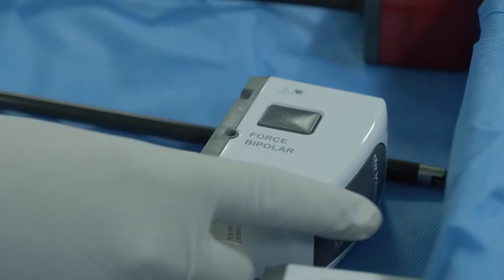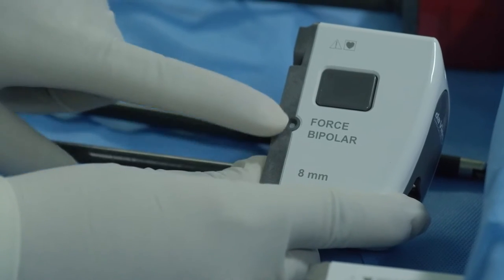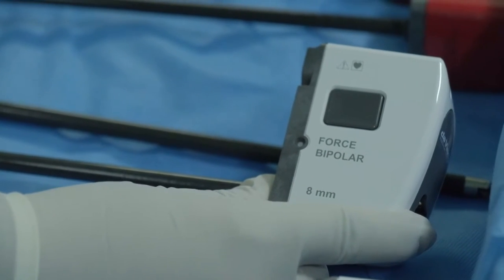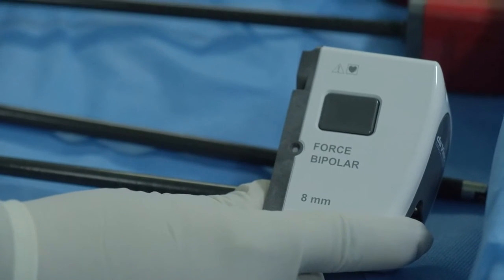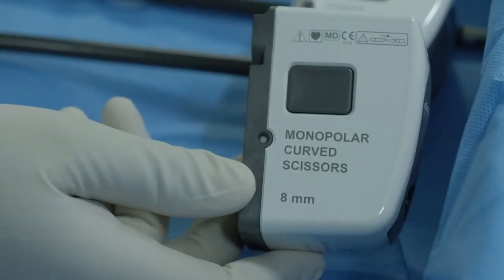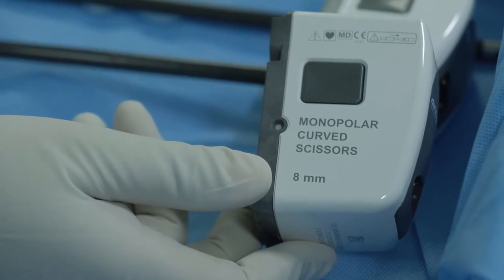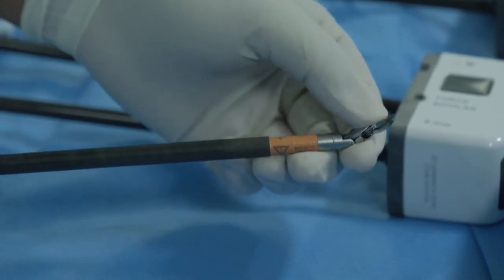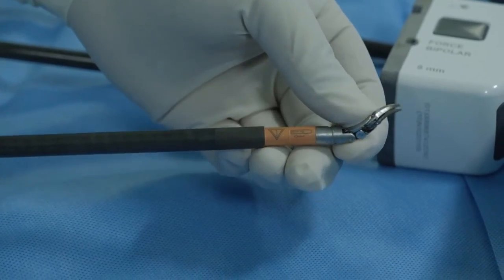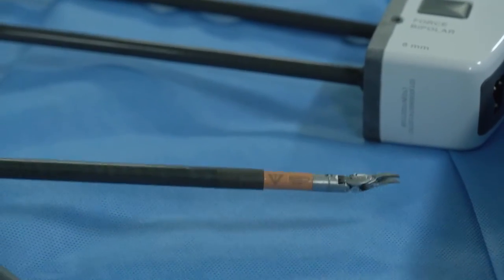This one is a force bipolar. So you can see this is a force bipolar 8mm robotic instrument, and this force bipolar has a bipolar energy, and it has a force, means it has a stronger grasp. There are monopolar curved scissors. It is a very, very nice instrument which we use daily in hernia surgeries, and it is again an 8mm instrument with a monopolar energy connected to it. So this is the scissors, and because of its curve as well as the 7 degrees of freedom, it is a very versatile instrument in robotic surgery.